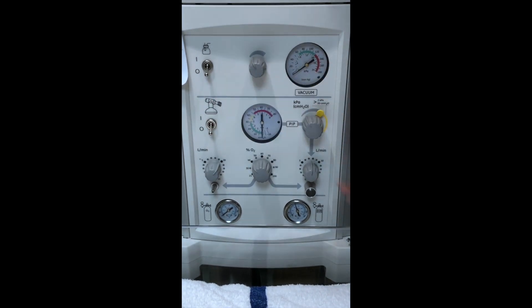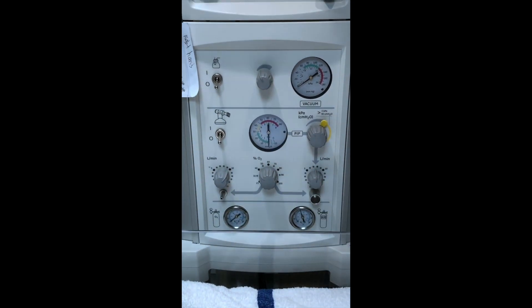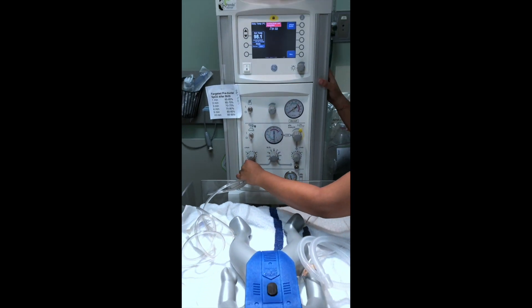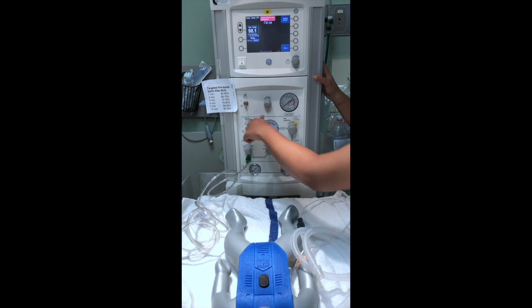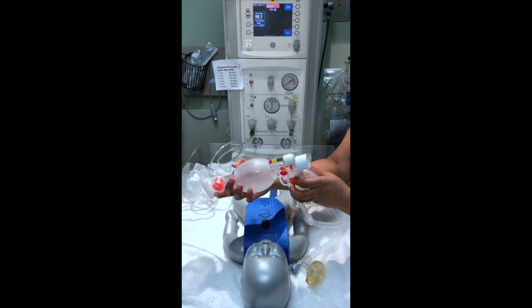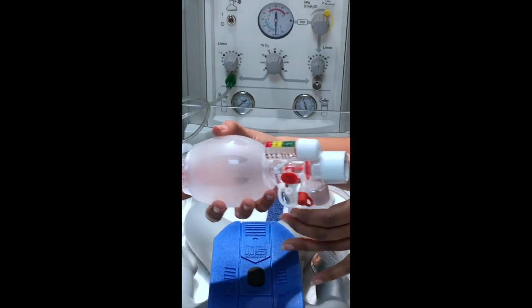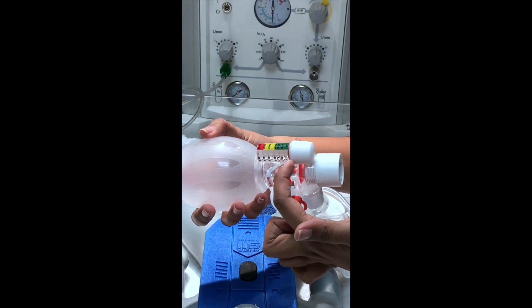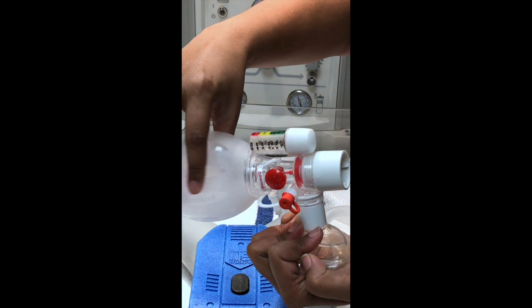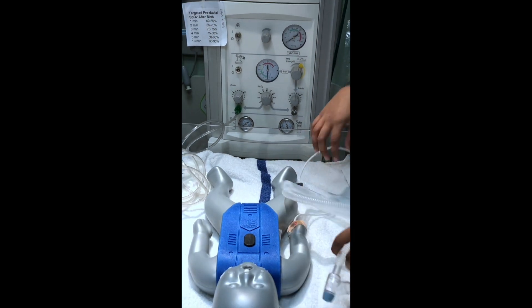Take this off for now. This side will be your BVM side; this side will be your NeoT side. So you can attach your BVM over here, turn on the oxygen, and you can bag the baby. The manometer is here on the pediatric BVM, and you want to stay within the green — so less than 20. However, it only takes just a little bit of pressure for you to get above 20, so there is another way to do that using the NeoT.